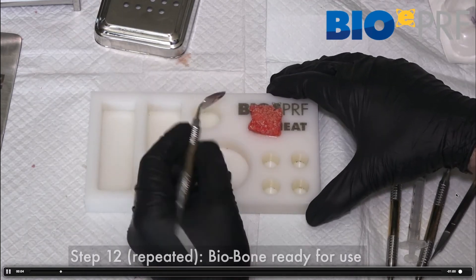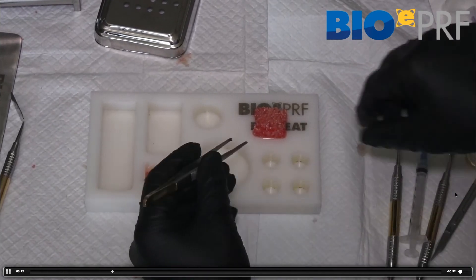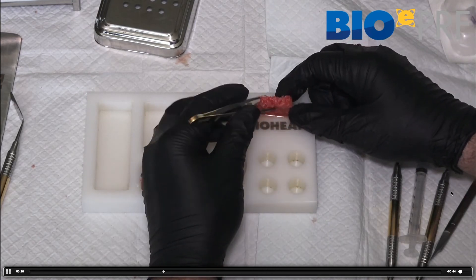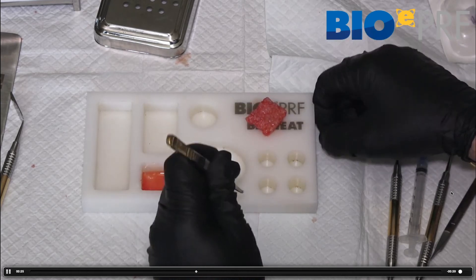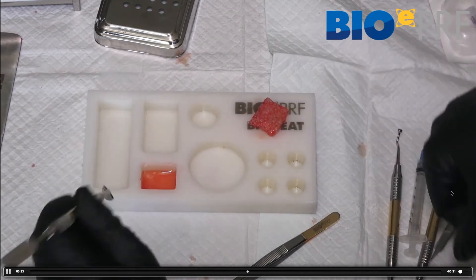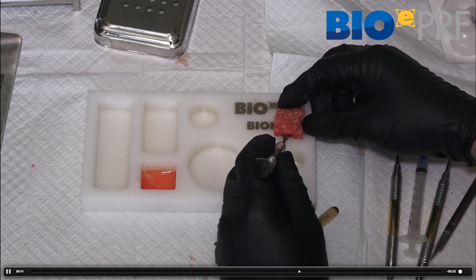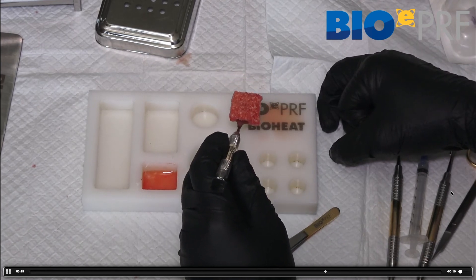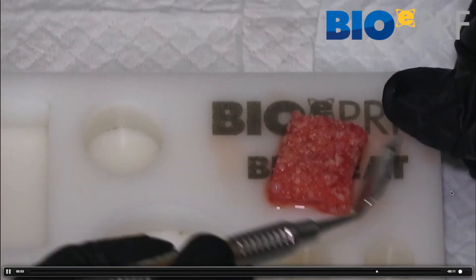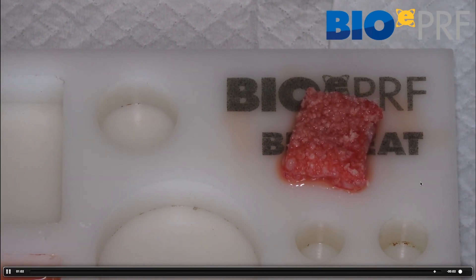Here's another video so you can see it coming out. Make sure you shape it correctly and keep it all intact. This can be used for sinus grafting procedures as well, where the extended PRF membrane can go up against the Schneiderian membrane to prevent it from interacting with the bone. More commonly it's utilized for GBR procedures, where you apply the sticky bone directly on the ridge and the outer surface serves as the extended PRF membrane. It has the same properties as an outer collagen membrane but is made all naturally, lasts four to six months, and is produced for only a few dollars.